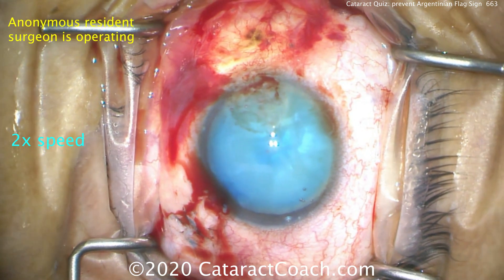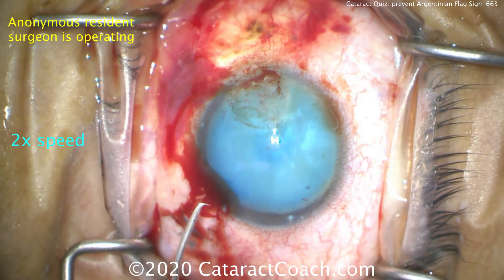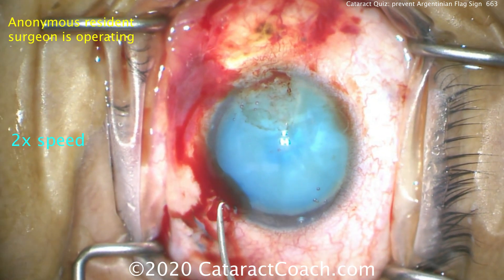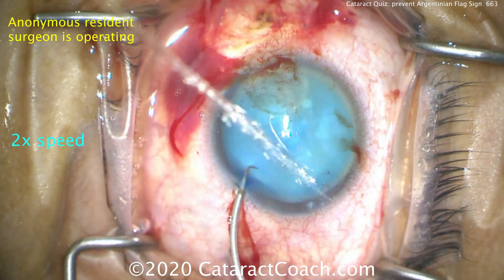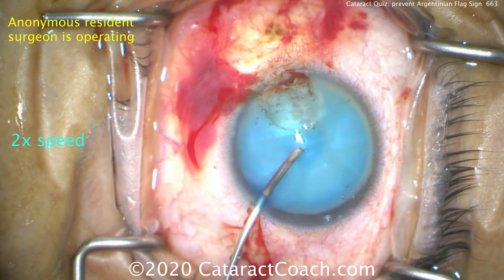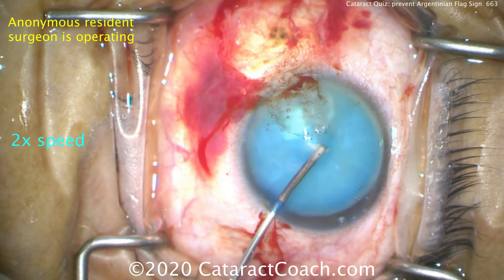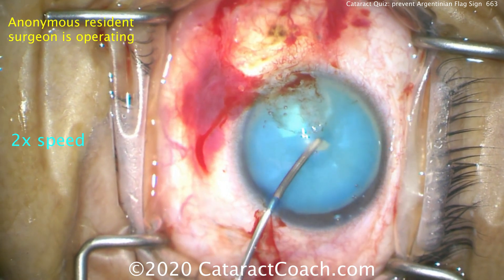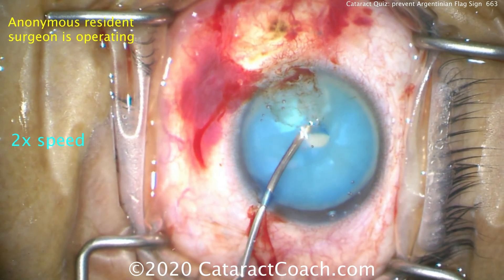We're going to go into that same side port now with no main incision, because with just a side port — a small incision — you can maintain a higher intraocular pressure, higher AC pressure. Then we're going to go in with the cystotome and poke the central lens capsule right in the center to see if we get any egress of fluid. Hopefully not, because the AC pressure is higher than the capsular bag pressure.